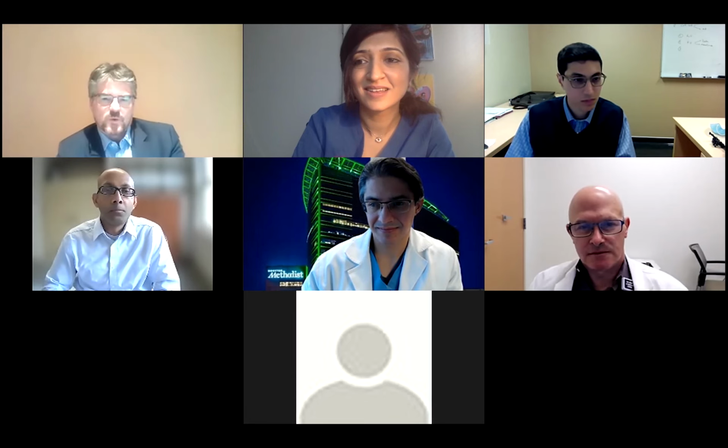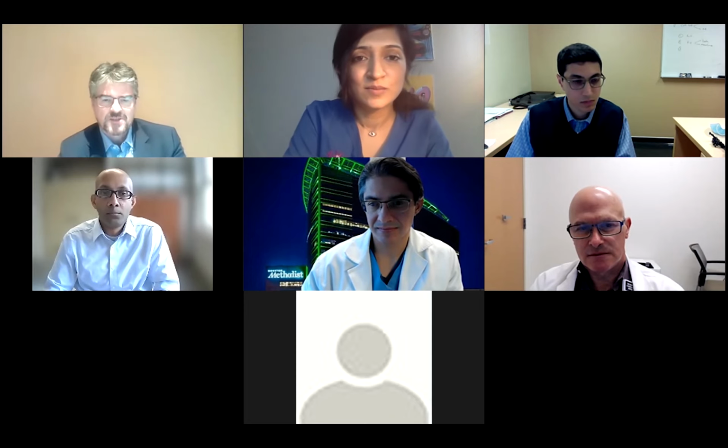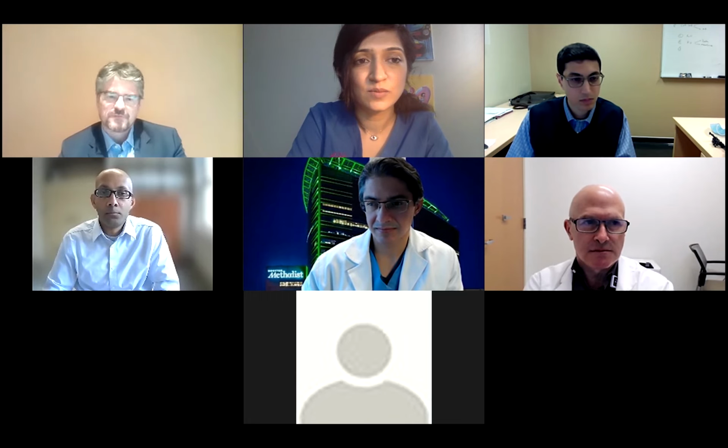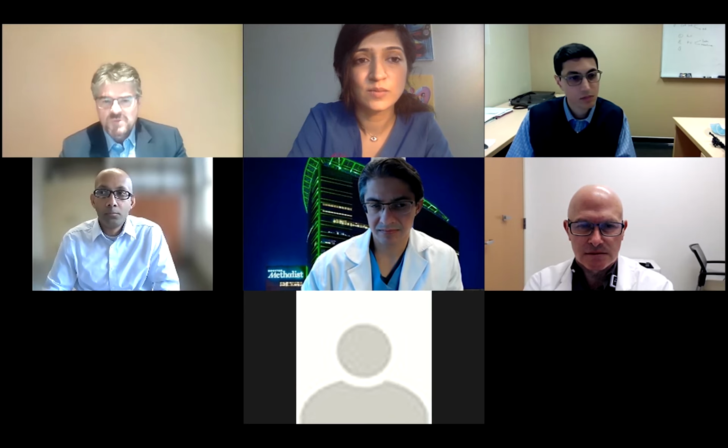So I personally don't like the ones with devices. Not that it's impossible to do the devices, it's just the effort is very high. The effort of getting someone to help getting the patient in, of looking after the patient while the ICD is switched off, then the artifacts are slightly more. Even though we can reduce the artifacts, they're still slightly more. And then there are alternative techniques for those, which may be easier. So that's one group where I tend to say, if there's another technique, why don't we use the easier approach for the whole system?